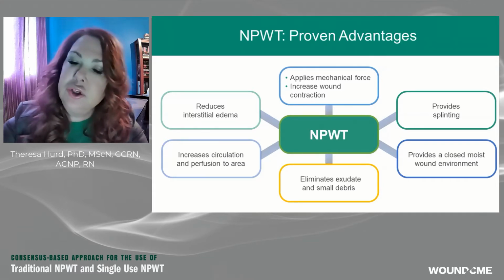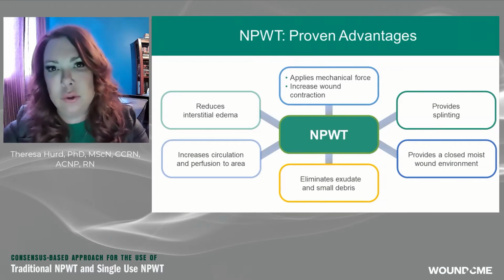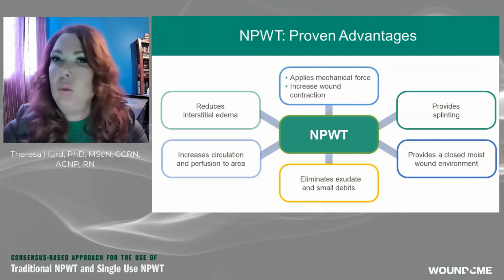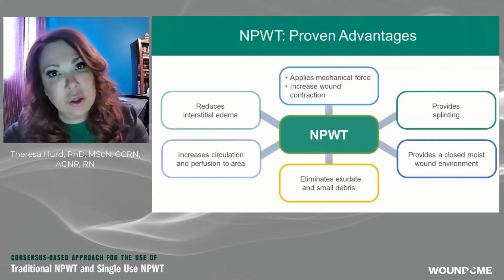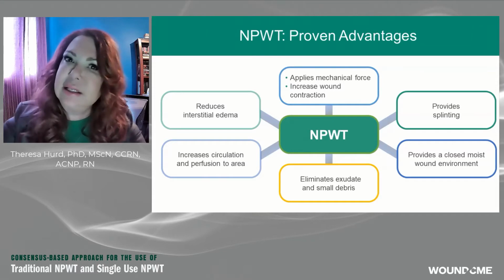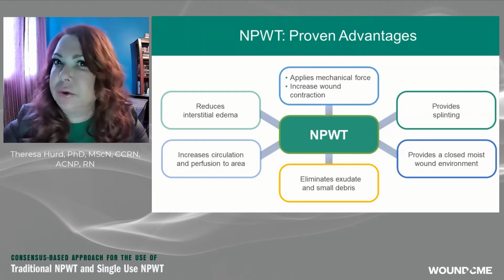So when you're choosing a treatment for your patient and you have a patient that has a wound, you need to make that assessment on the patient like you would for any kind of treatment. You want to take in the psychological. You want to take in the wound itself, and you want to make an assessment of that patient to how much risk you can afford if you don't use a particular treatment.